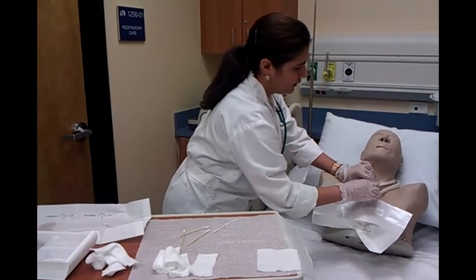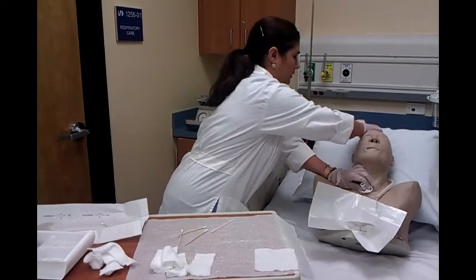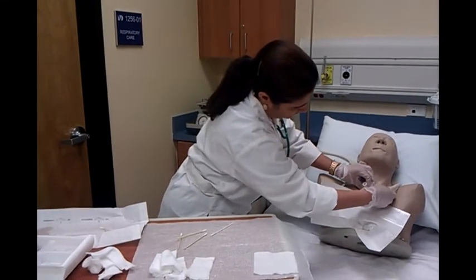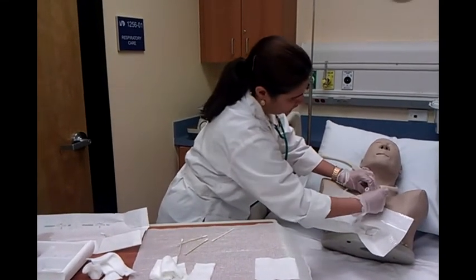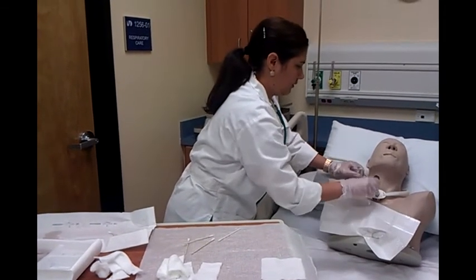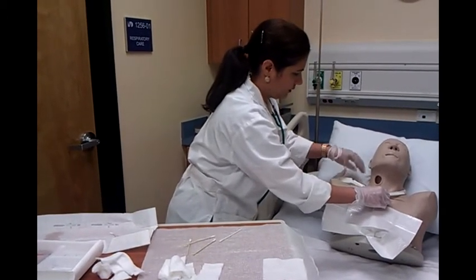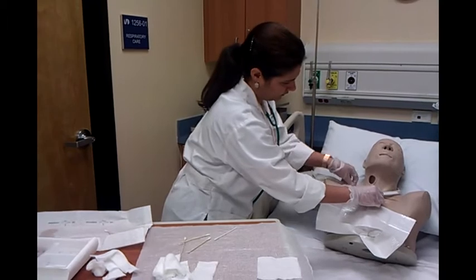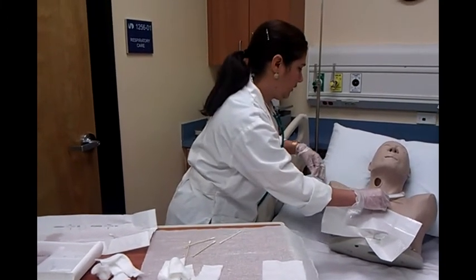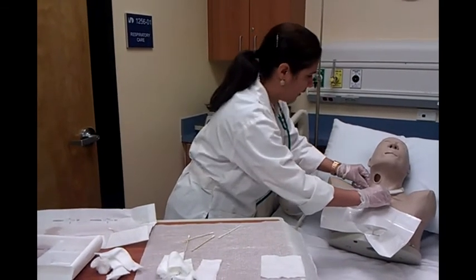I remove the first part. I have to be careful. The stoma must not come out.